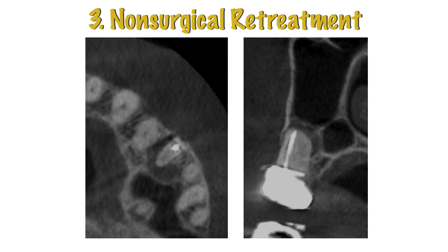This is an axial view. You see this is the mesiobuccal root. The cortical bone here is gone in this area, or very thin at least. Then you see that the lesion is kind of wrapping around more the lingual side of the root. This is MB2. MB2 was missed. So when we look here at the coronal view, we see MB1, MB2 was missed, and there was a little bit of a lesion there, but the lesion was wrapping around.